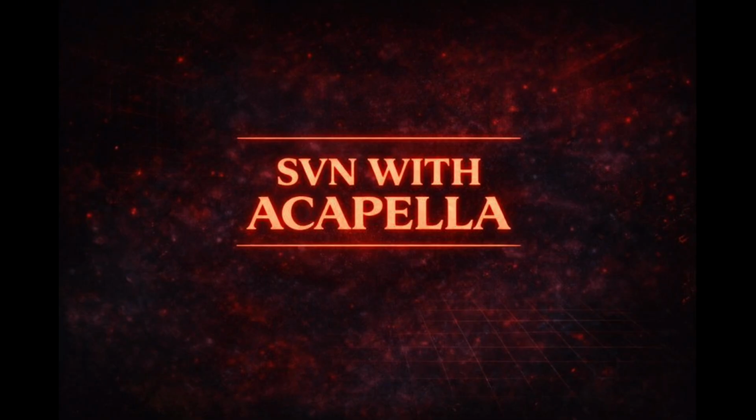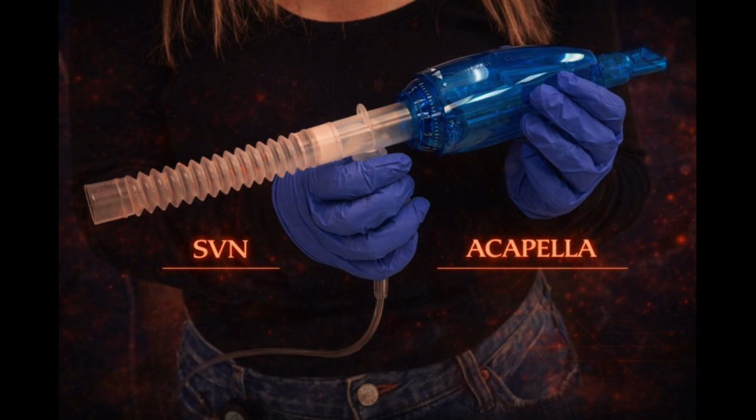Part 3. SVN and Acapella used together. Why use SVN and Acapella together, or combination therapy? When the small volume nebulizer is used together with the Acapella device, the patient receives medication delivery and airway clearance at the same time. The nebulizer delivers aerosolized medication to help open the airways, while the Acapella provides positive expiratory pressure and vibration to help mobilize secretions.